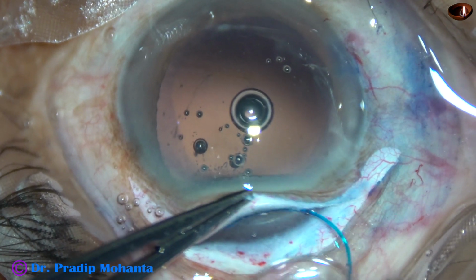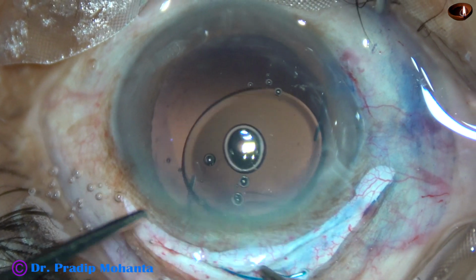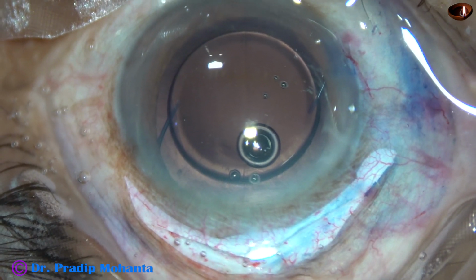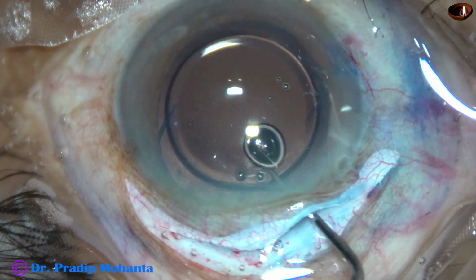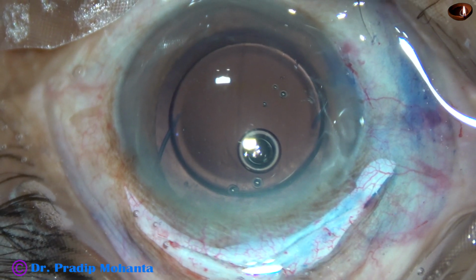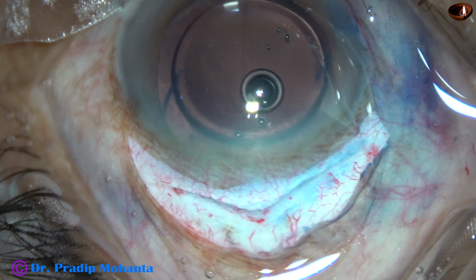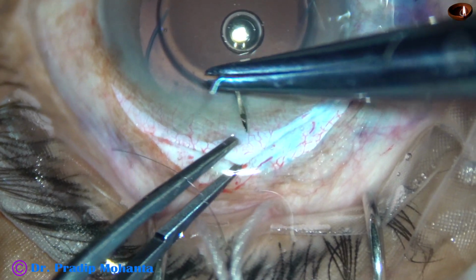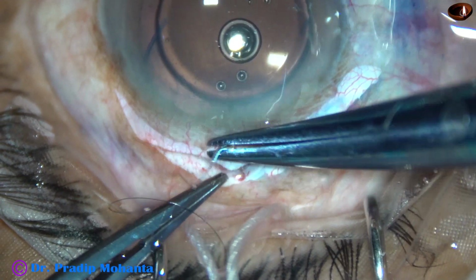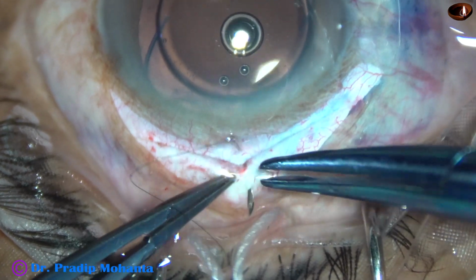This is a Sensar multi-piece intraocular lens going in unfolded. Because the wound is so large, we need not fold this lens. The lens has gone into the capsular bag, and now I'm going to put a suture at the apex of this V-shaped incision. Apex means the joining point of the two SICS wounds.